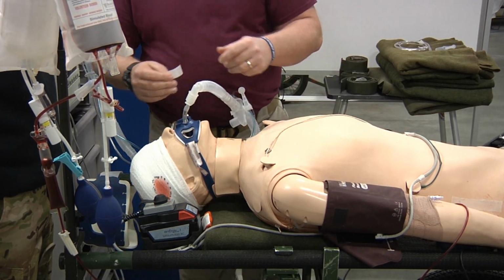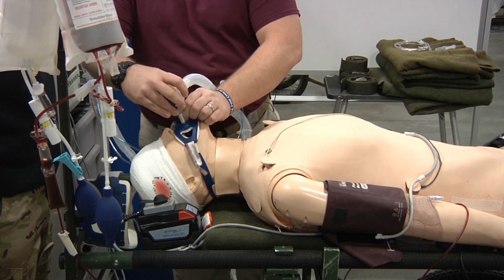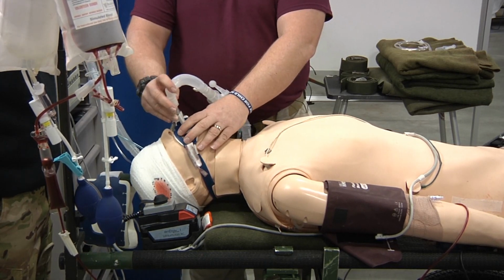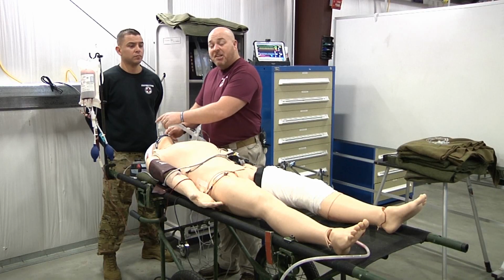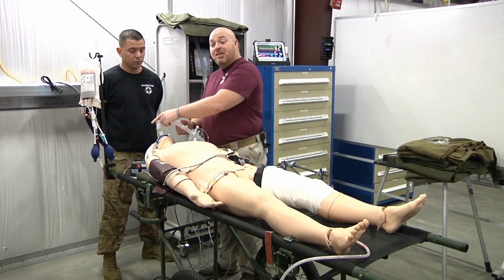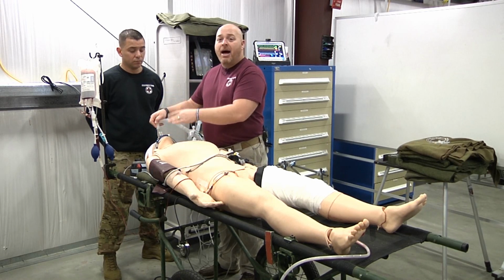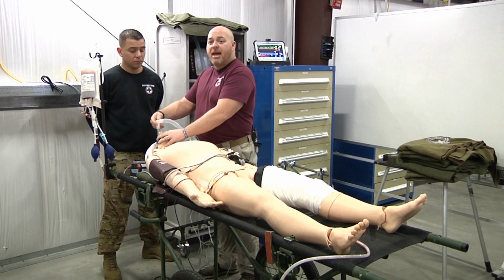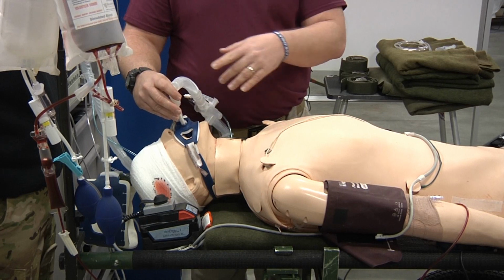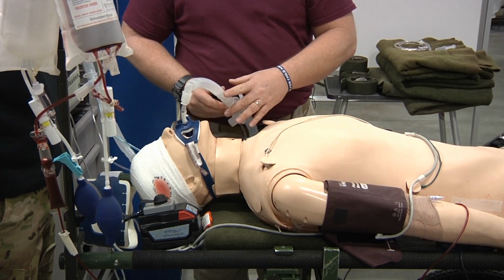And what I mean by flag is we're going to take this tape and place it up here like this, and it's going to wave like a flag in the sky. In the aircraft, we're not going to be able to check the numbers on the tube as easily as we can in the environment that we're currently in. So by placing the flag up here, it gives us a symbol of whether our ET tube is still in the appropriate spot. If it is way up high, flagging in the air, we know that we possibly have a dislodgement. If it is pushed down too far past the ET tube holder, we know that maybe we have a right mainstem. So this is a good indicator and a quick reference for evaluation of the position of our tube.